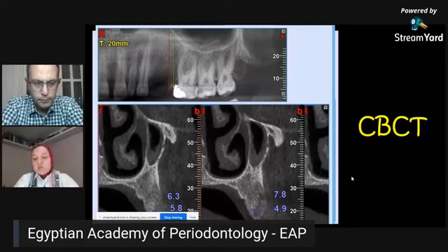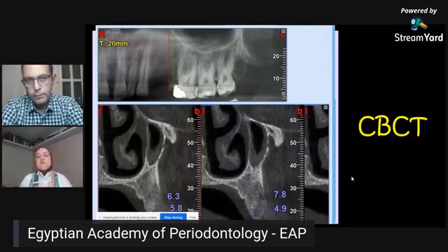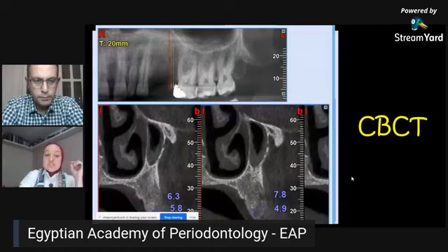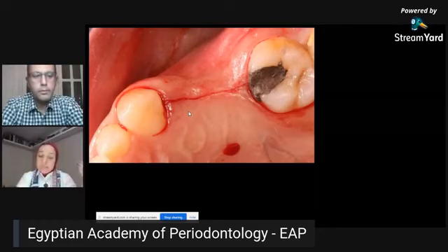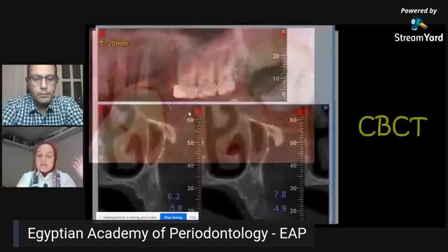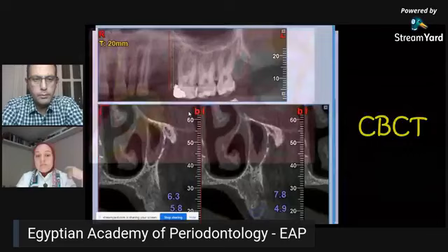But then when you read or you get more knowledge about prosthetically driven implant placement, you don't depend on the cone beam alone. You have to check your clinical view. Because maybe you have enough bone buccolingually, but you have to place the implants too palatally. And it will be impossible to restore if you don't place your implants prosthetically driven. As you can see in this case, the cone beam looked fine. We had something that looked like enough bone in some areas. But then when you look clinically, you'll find a huge buccal depression.